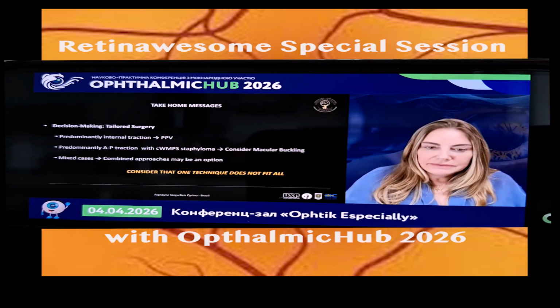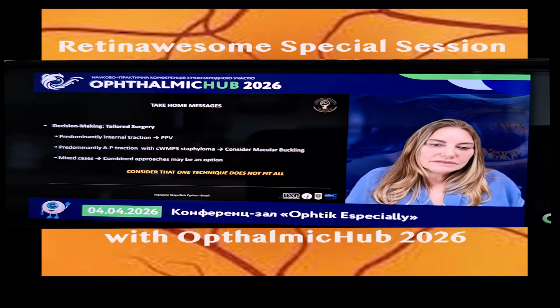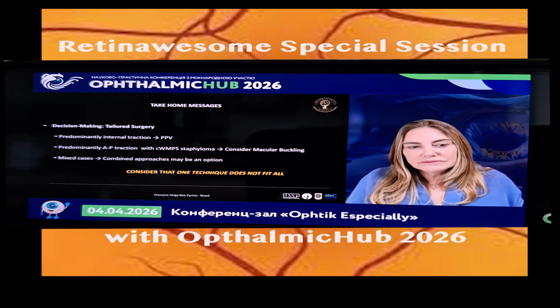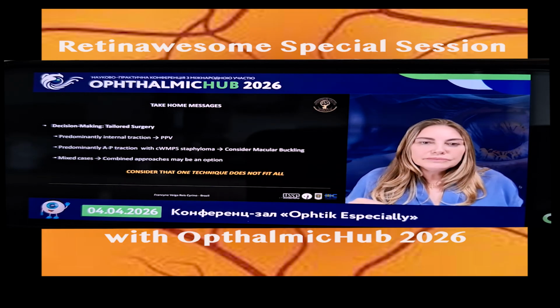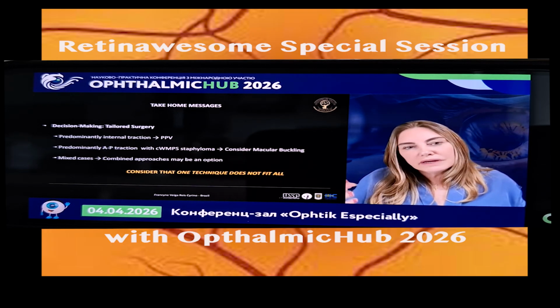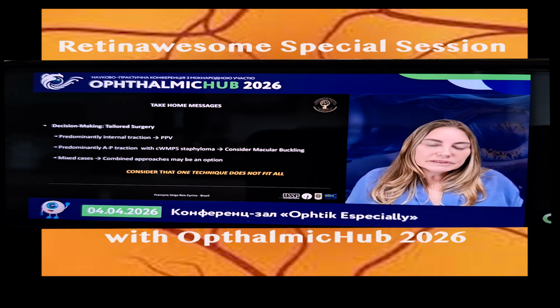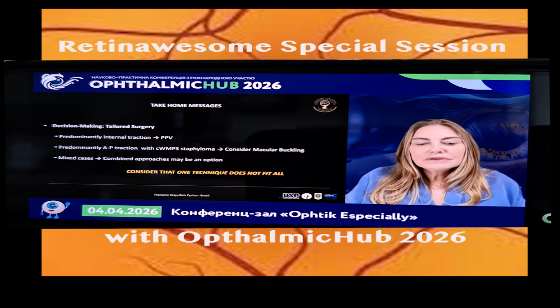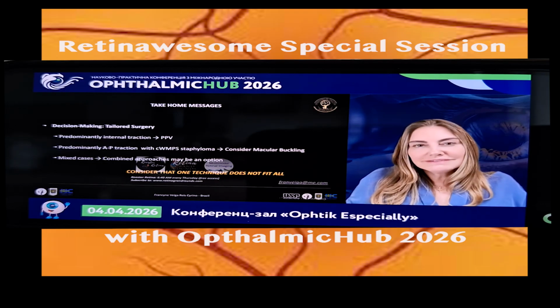And the point is, when I think about all of this, I think we have to make a decision in tailored surgery, on which course we need to treat. So if you have predominantly internal traction, we should think about only vitrectomy. But if you have this anterior-posterior traction with a big compound form of wide macular posterior staphylomas, you have to consider macular buckling, or even failure in the previous surgery. And in mixed cases, a combined approach. Consider that one technique does not fit all the cases. Thank you so much.